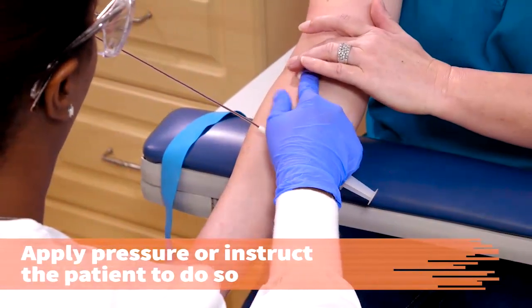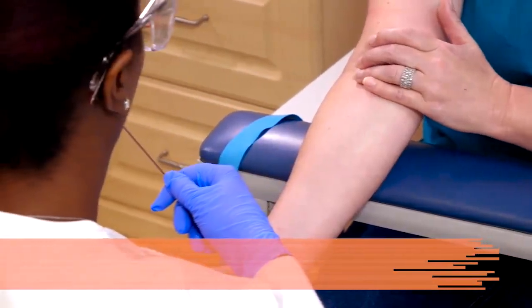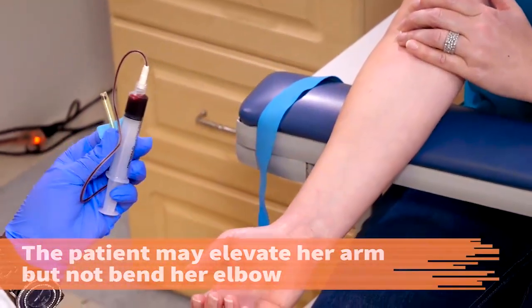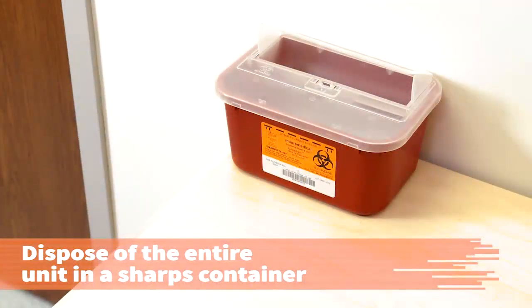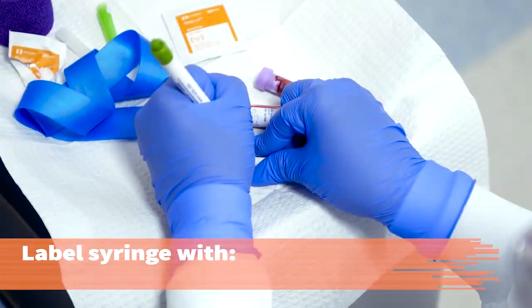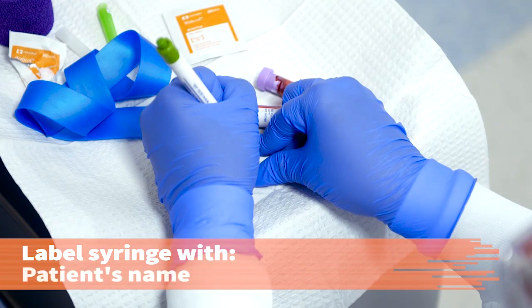Apply pressure to the gauze or instruct the patient to do so. The patient may elevate the arm but should not bend the elbow. Dispose of the entire unit in the sharps container. While the patient is applying pressure to the site, label the syringe with the patient's name, date and time, and your initials. Or, affix the pre-printed tube labels and print your initials on the label.